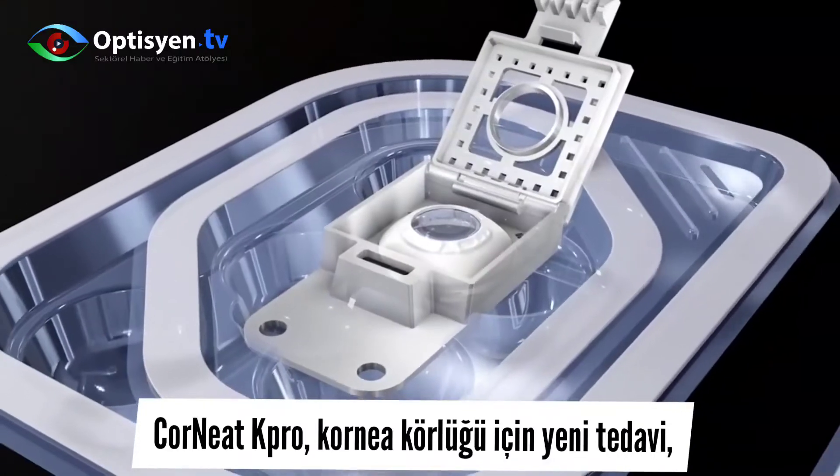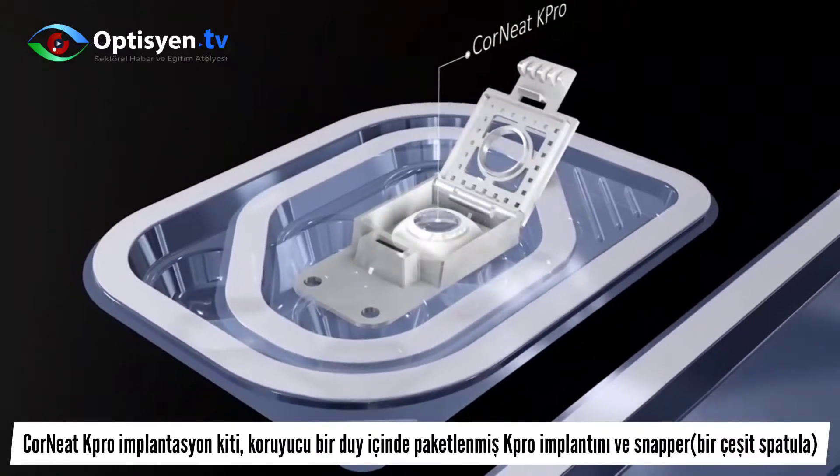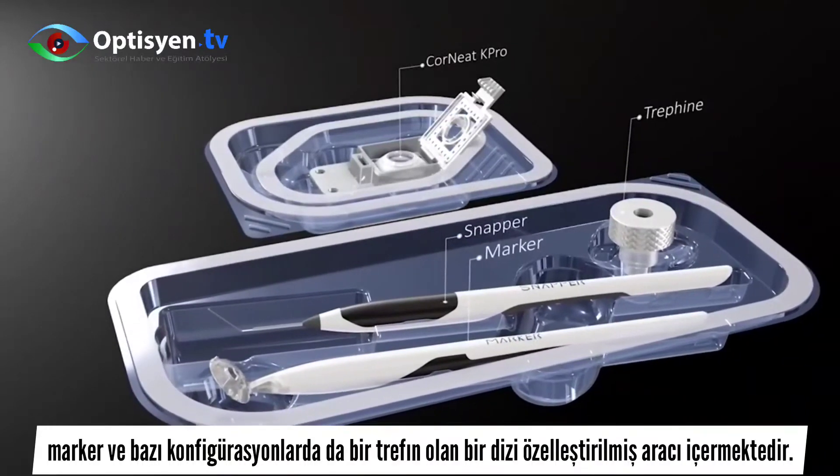The Corneat K-Pro Implantation Kit consists of the K-Pro implant, packaged in a protecting holder, and a set of customized implantation tools: the snapper, marker, and in some configurations, also a trefine.